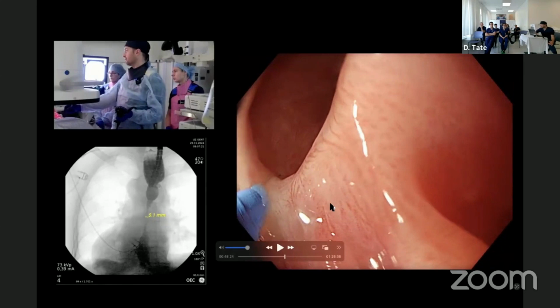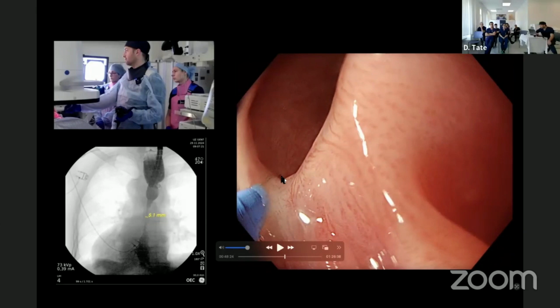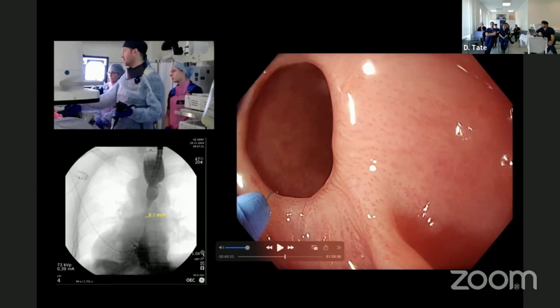Yeah, here, right? This is going to perforate. Why? 2 points of this are going to perforate. 1 point at the tip. You see the tip is embedded in a wall behind, and when you press that pedal, it's going to cut directly down. So this is a very difficult thing for me to watch someone else do. The person I'm watching has to have the best tip control before I'm letting this out of my hand, because you need to maintain this position at all costs before you press the pedal. And then, the next thing the person does when you're training them is they look at the pedal, right? And at that point, the scope has moved. And it makes me crazy, and then I want to take it. As a trainer, this is extremely difficult to handle.